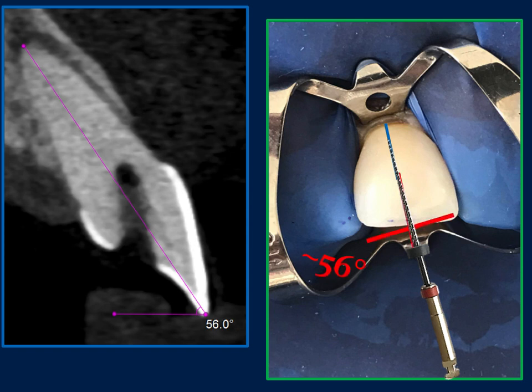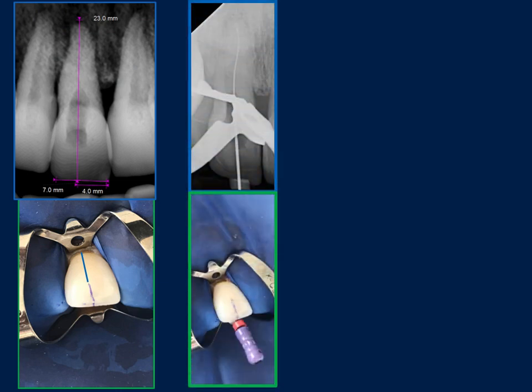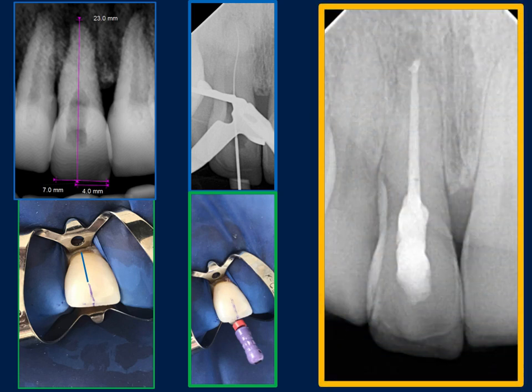Then I will go directly to the canal. So let's go with this file inside. So this is the final result. Then I will prepare, clean and fill the canal.